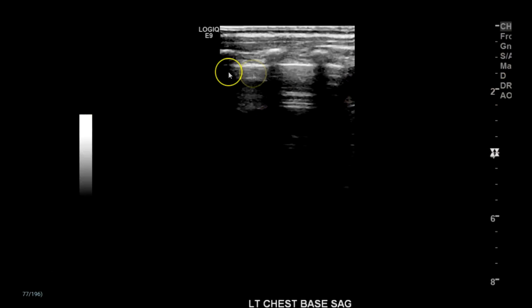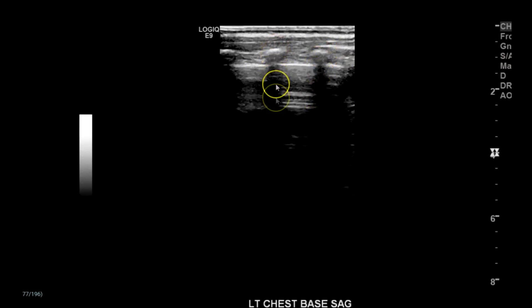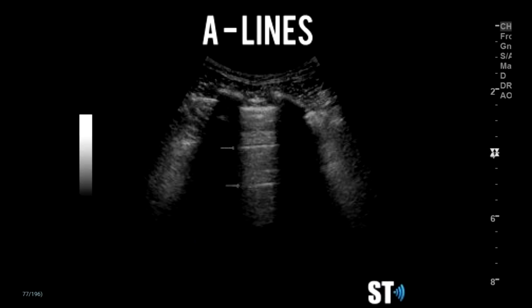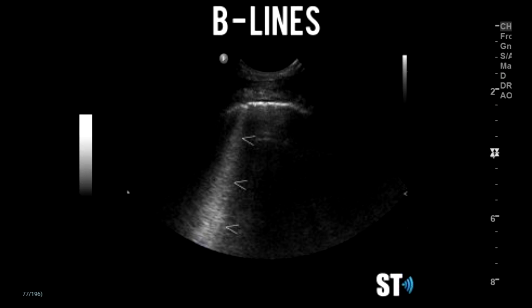And here's the left side for comparison. You can see the ribs with shadow, a very clean pleural line, and then the A-lines, which are reverb from the pleural line. You don't see any of that haziness that you see in the mid-chest on the right, which could also be pulmonary edema.